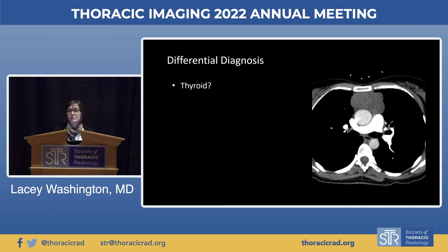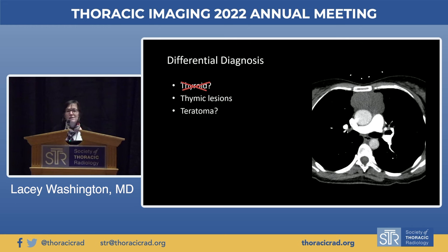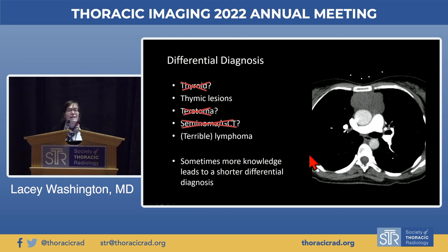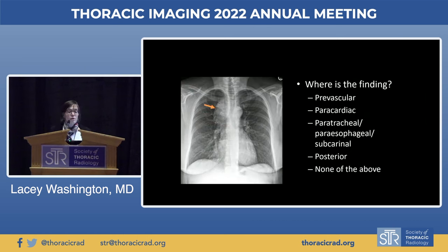On CT, we can work through the differential: thyroid? Wrong location. Thymic lesion? Possible, depending on the patient's age. Teratoma? No — it's a very bland, homogeneous anterior mediastinal mass with no fat, no fluid, no calcification. Seminoma or germ cell tumor? There's breast tissue visible on this patient — this is a young woman, and those are tumors of men. Lymphoma? Yes, this could be. Depending on age, this will be either a thymic lesion or a lymphoma.